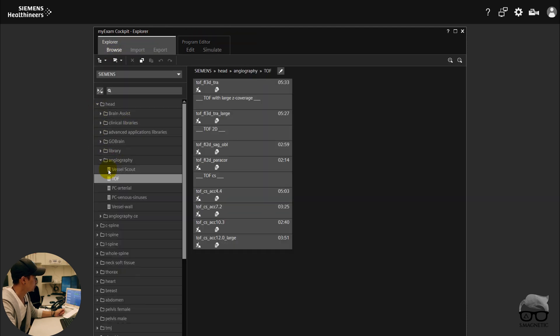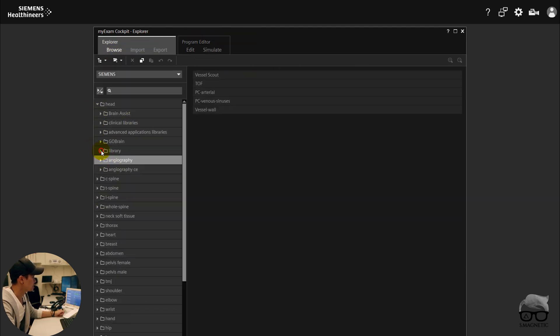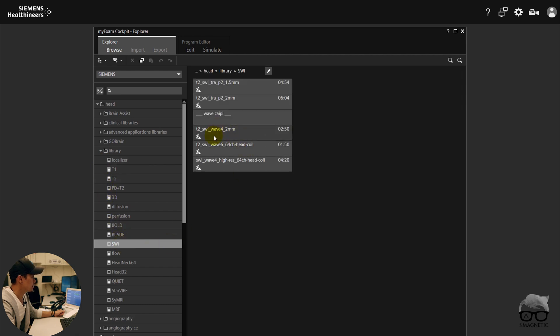And then you have a lot of different sequences here — so many new things. You have Wave SWI, which makes things faster. It's a whole new approach. Like I said, I can go through this in another dedicated video in more detail. Let's just check the other screen.